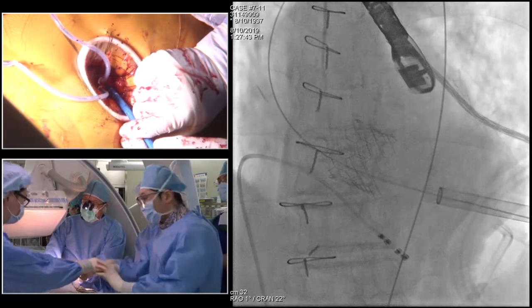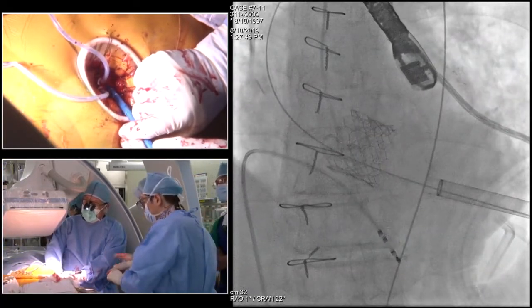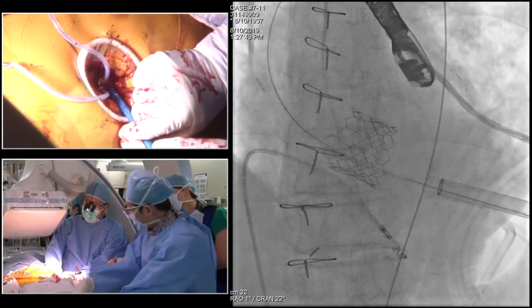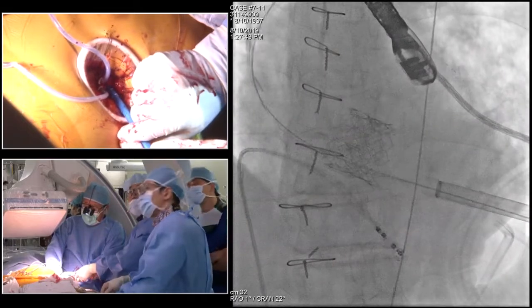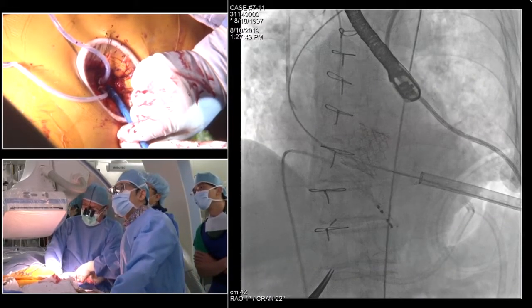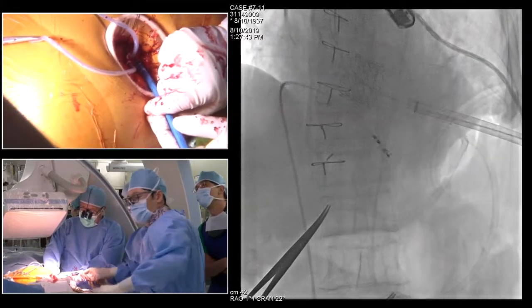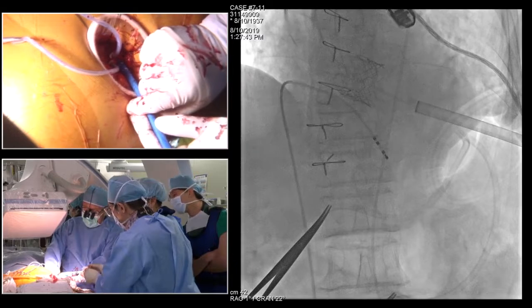And then insert the right coronary. Oh, gonna put a catheter. Okay. And then we exchange to the. 자, 천천히. 자, 잡고. 자, 보면서. 자, 아직. 들어갔지? So you're placing a catheter to remove the wire? Yeah, 들어갔지? Okay, 됐어. 자, 테르모로 한 번에 다 빼고 파이널 찍자.